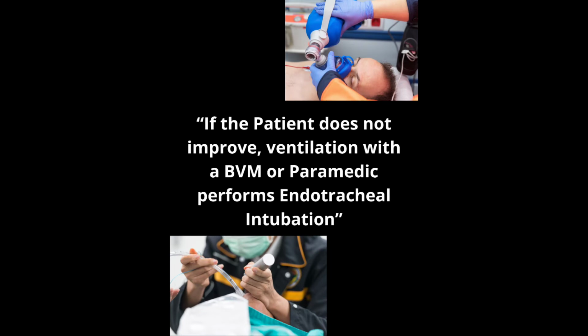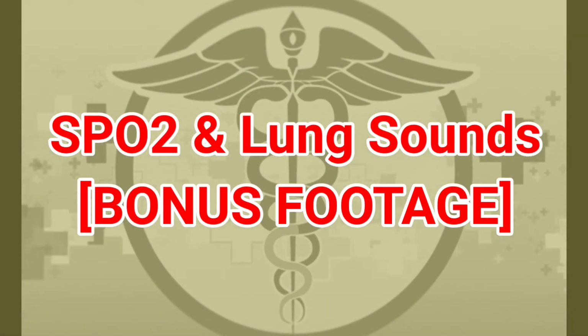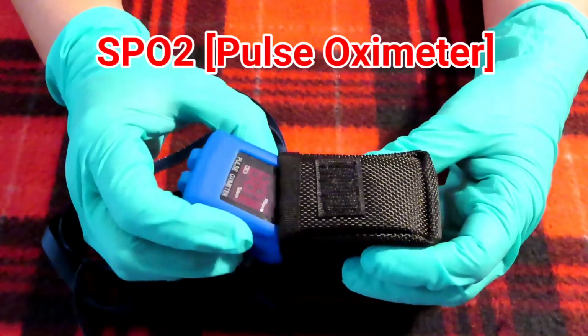If the patient does not improve, ventilate with a BVM, or have the paramedic perform endotracheal intubation if necessary. I would notify the receiving hospital that the patient is on CPAP." SpO2 and lung sounds, bonus footage. For the purpose of this skill, you may not be required to use the SpO2. However, on a real patient, you will be using it.